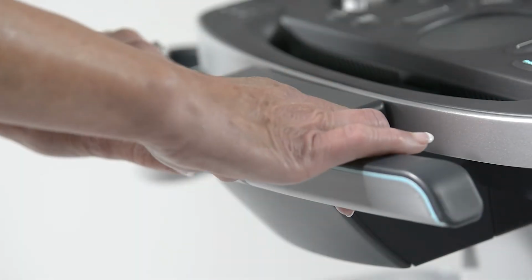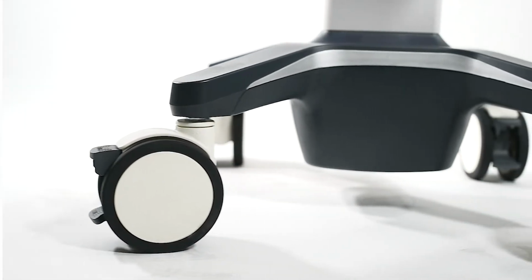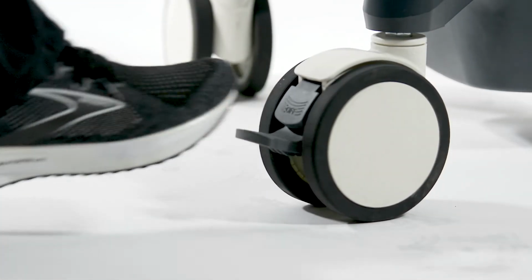To adjust the height of the system, depress the handle on the cart to raise or lower. To lock the wheels on the cart, press the lever at the top of the wheel. To unlock, lift the same lever on the wheel.